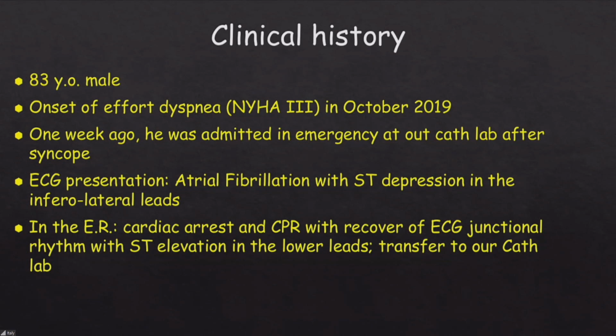We are going to present a patient of 83 years old, male, average age and weight. The patient had an acute coronary syndrome 1 week ago, and he was admitted to our department with a junctional rhythm and with an onset of effort dyspnea from last October.